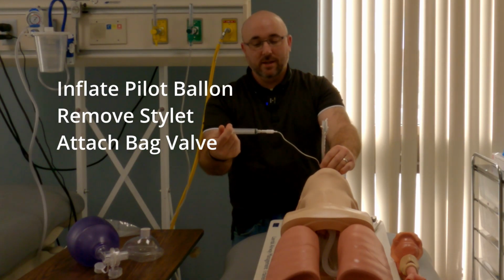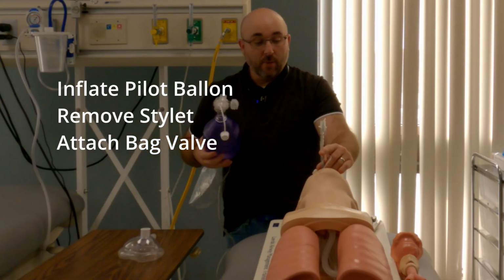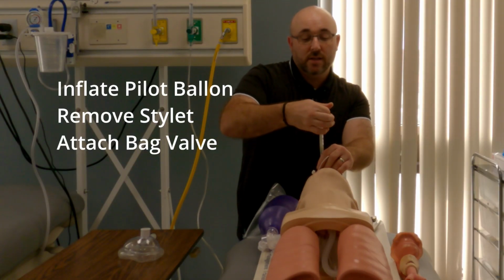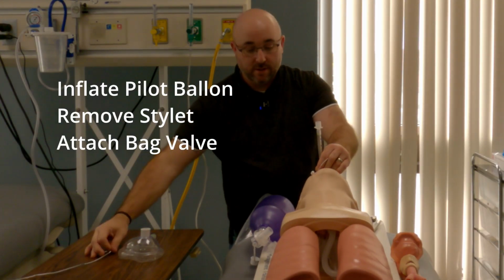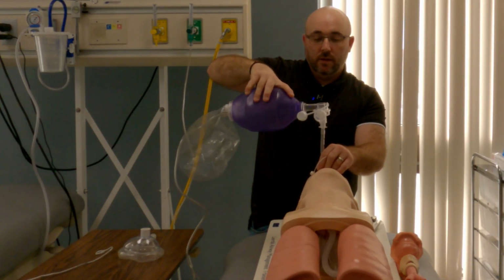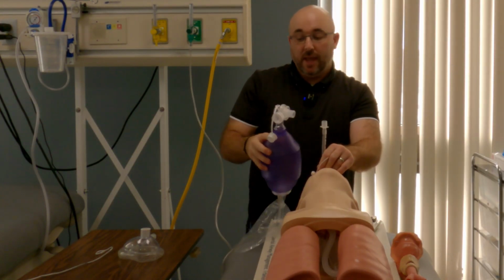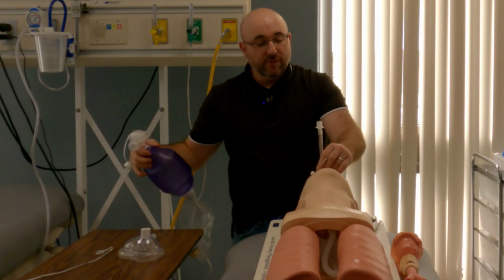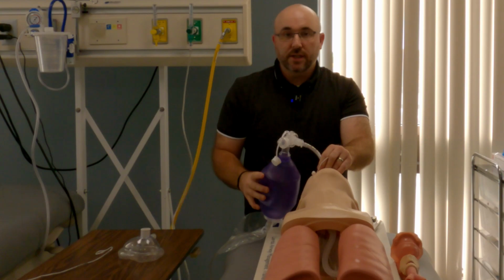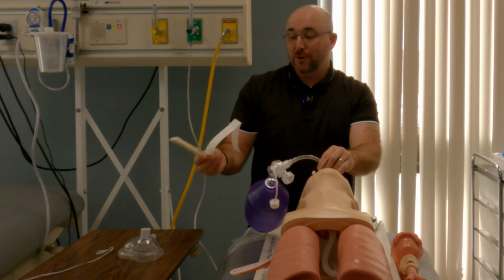Inflate this. Pull that off. We have a secured airway now, so when we deliver that breath, it's going to go directly in the lungs. This piece comes out. This attaches. And we give a breath and we can verify the endotracheal tube's in. At that point, we're going to continue ventilating until we go to secure the endotracheal tube with the commercial device.